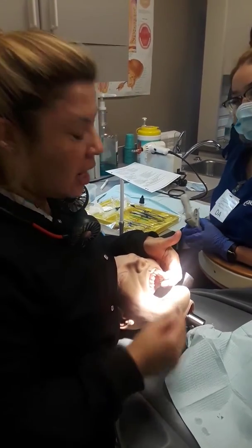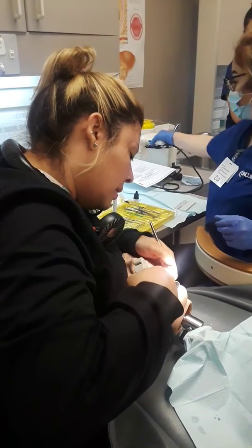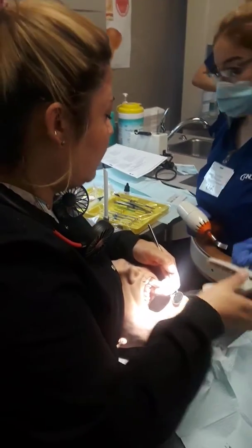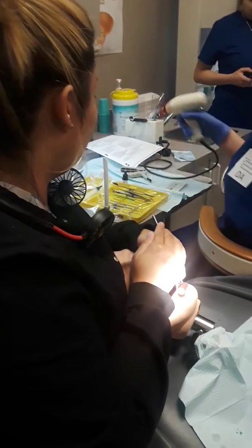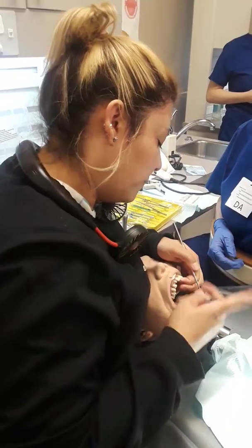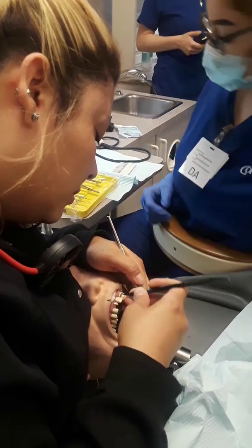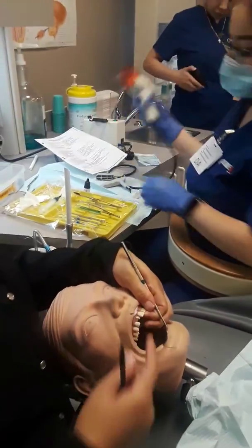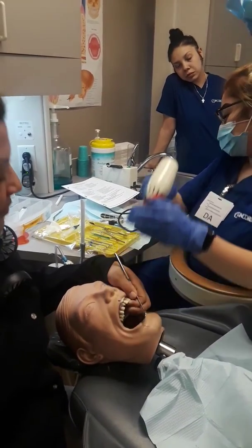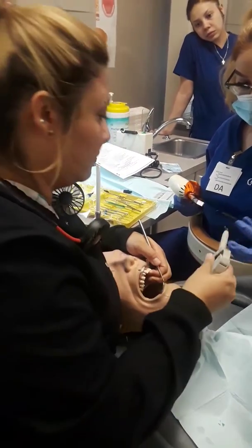I'm focusing on holding that lingual and then I'm going to squirt some composite into my prep — in two-millimeter increments. Move my light away so it's not curing on the tooth prematurely. Push it in where it needs to go. She's going to cure, and we add in layers — two-millimeter layers until we're full. Twenty seconds, then add another two-millimeter increment — that's almost full.